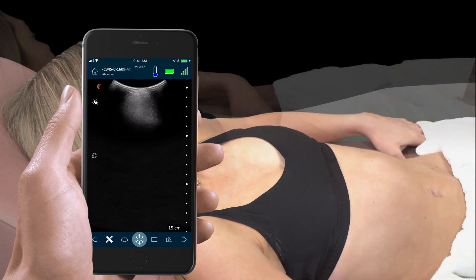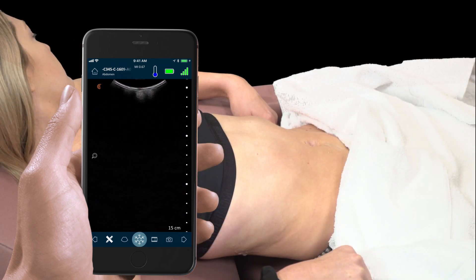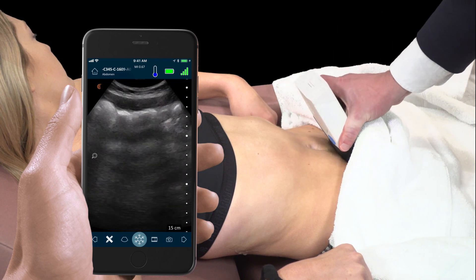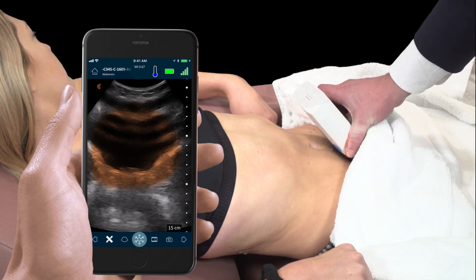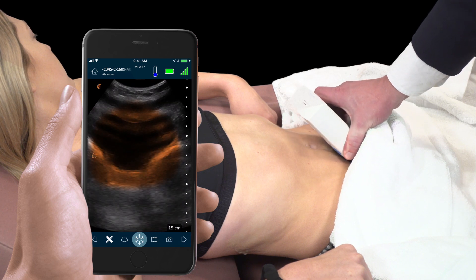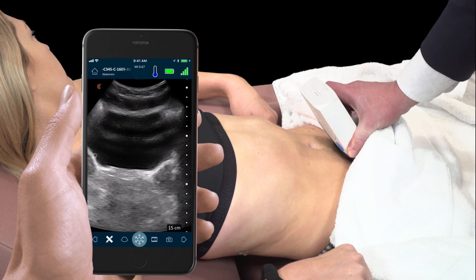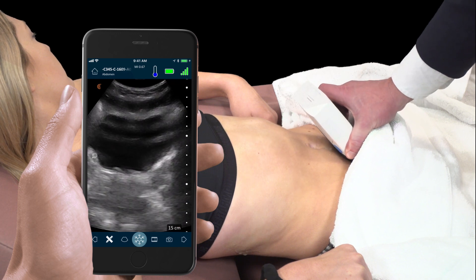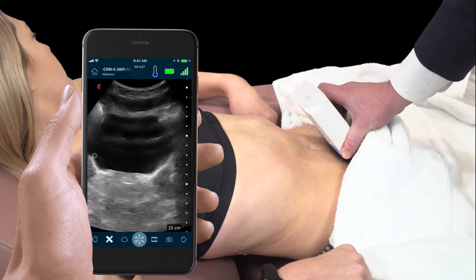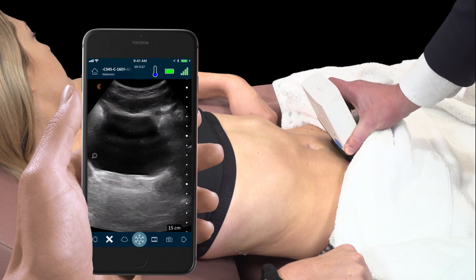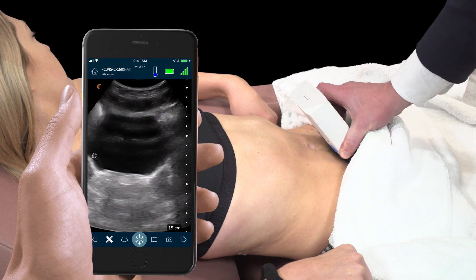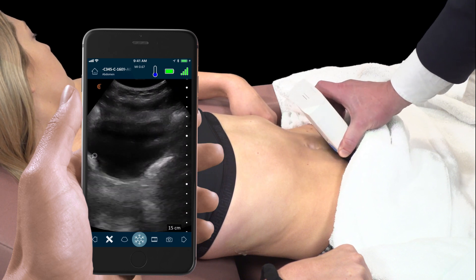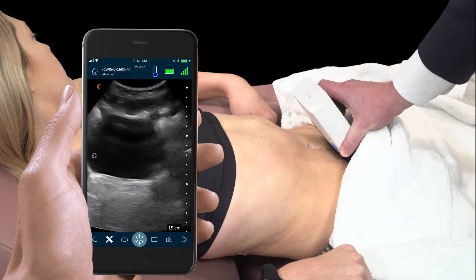Let's move on to the bladder. To visualize the bladder, we place the scanner on the abdomen and fan down almost all the way to the symphysis pubis. Here we see a very dark, anechoic, fluid-filled space with posterior acoustic enhancement. To estimate bladder volume, you can measure the bladder in three dimensions.